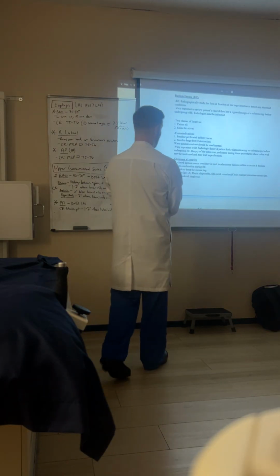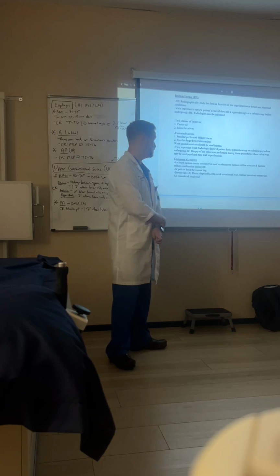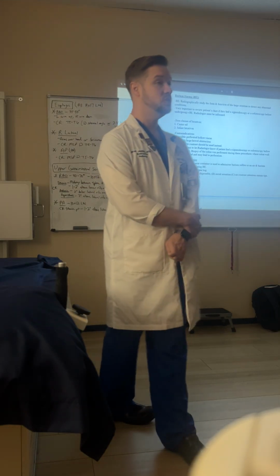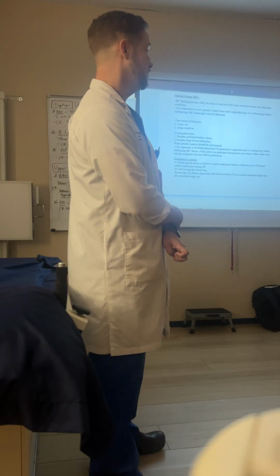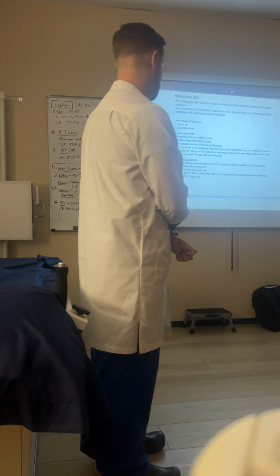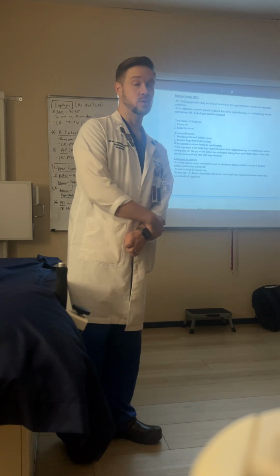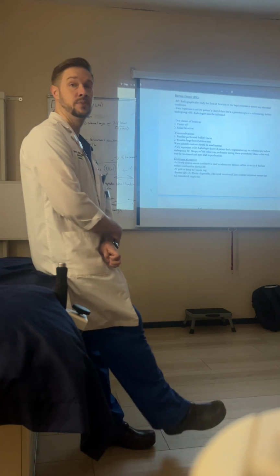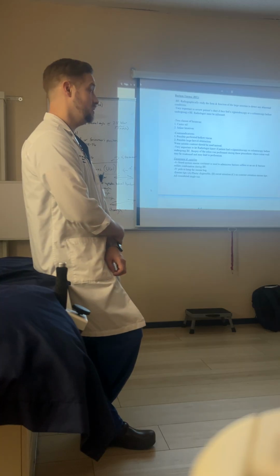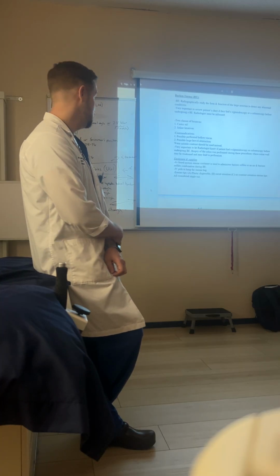A closed system enema container is used to administer the barium sulfate or an air and barium sulfate combination. So you can do single contrast BE or double contrast. Single contrast, same rules, is going to show the shape. Double contrast is going to show if there are any polyps or lesions inside the mucosa of the large intestine.